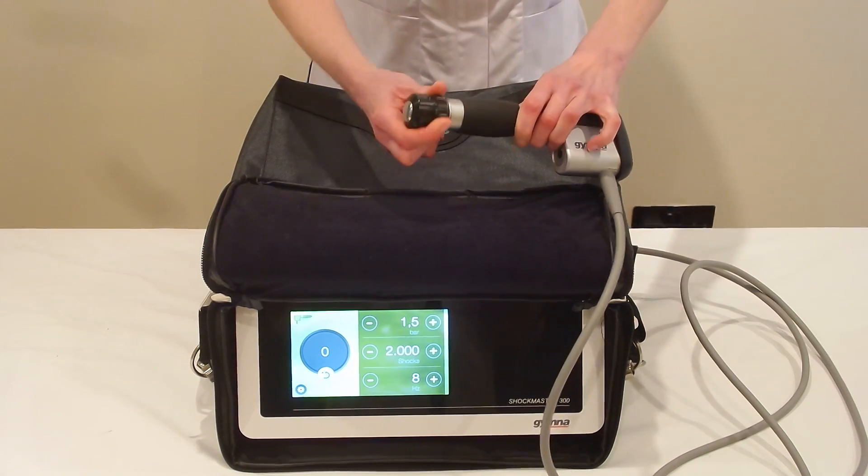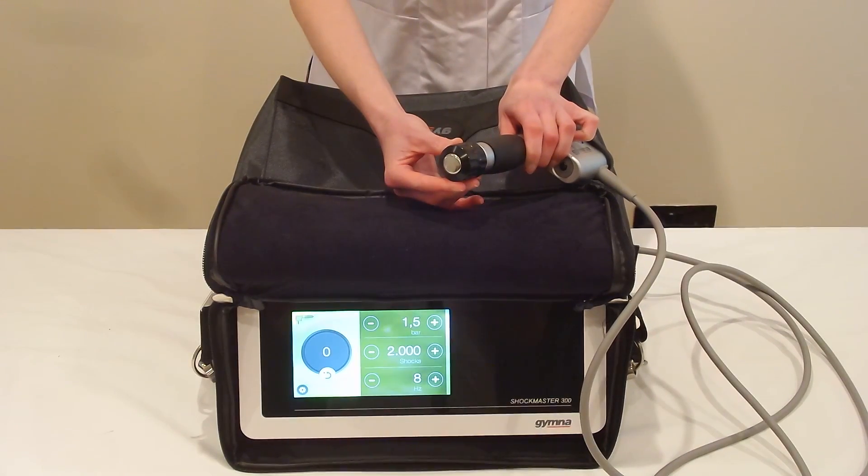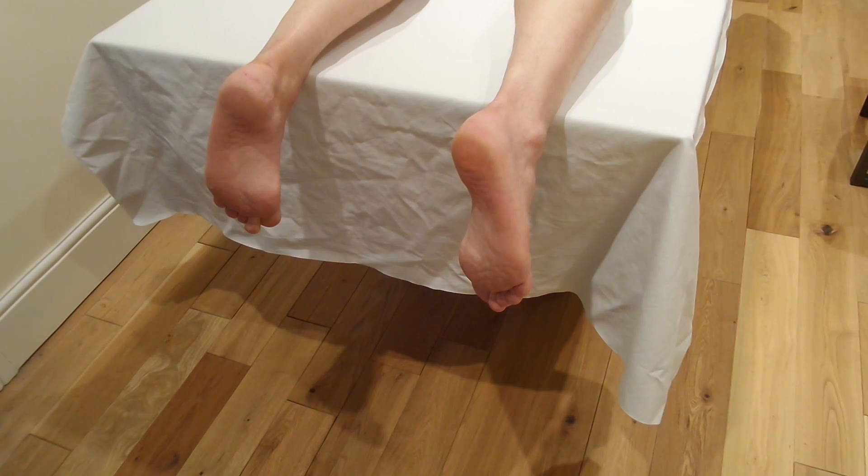This treatment covers the whole of the plantar fascia and can be quite uncomfortable, so before you apply it do be warned.